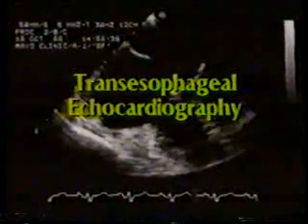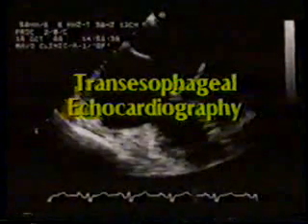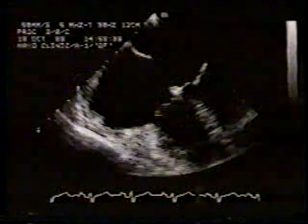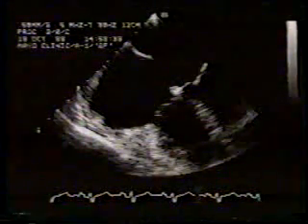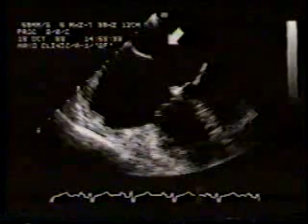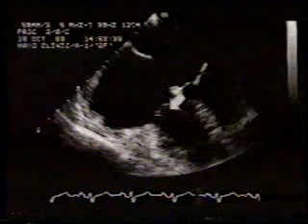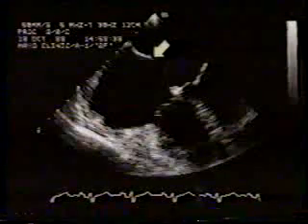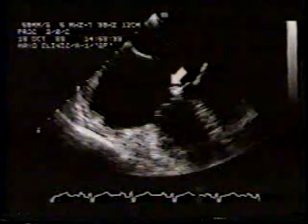This next example is the transesophageal echocardiographic examination of a 39-year-old patient. This patient had a poor quality transthoracic study because of marked obesity. In this view, the left atrium and left ventricle are here, right ventricle and right atrium in this position. Note this large ostium primum atrial septal defect is clearly visualized.